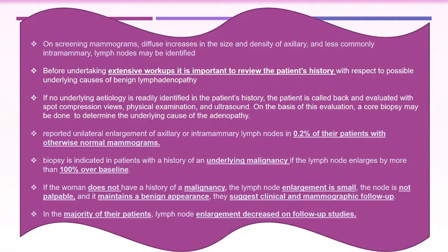And we have to compare with previous. If the patient has underlying malignancy and the lymph node is enlarged by 100%, meaning doubled in size, then we have to recommend biopsy.